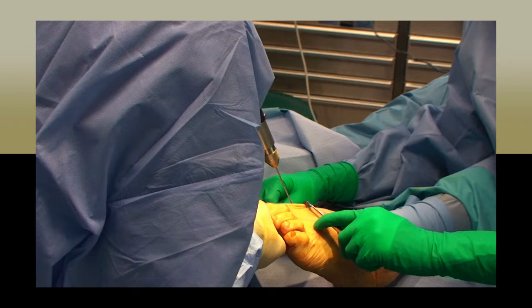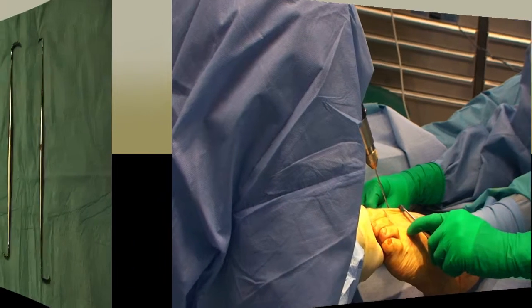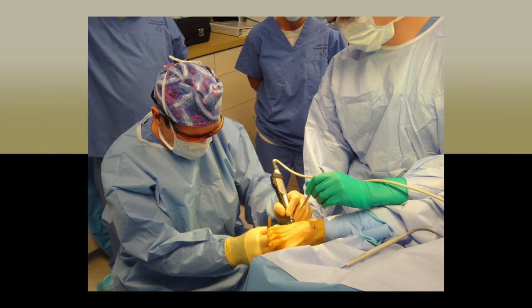The main retractors used in our surgical center are the blunt and sharp Sen retractor. This allows you to retract the skin and tissue so the physician can see well. Your job is to place the retractors where the physician desires and stay put without moving until you are instructed by the surgeon. It can be difficult at times, and if you feel you must move, verbalize to the surgeon you need to adjust before moving. He may be in the middle of an important cut or placement.